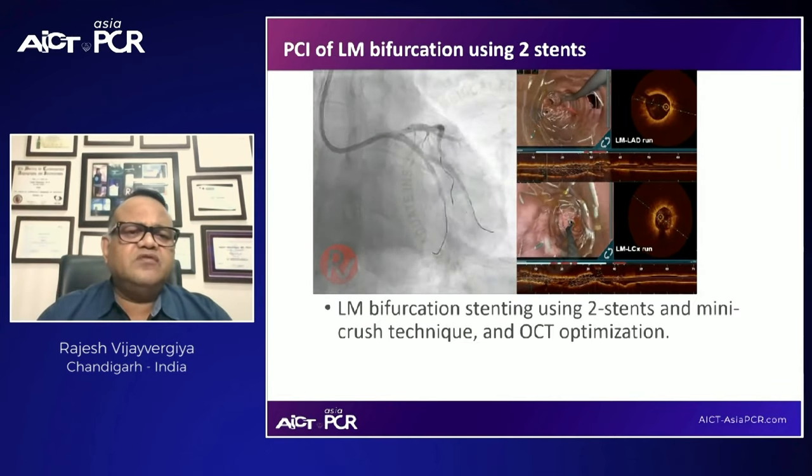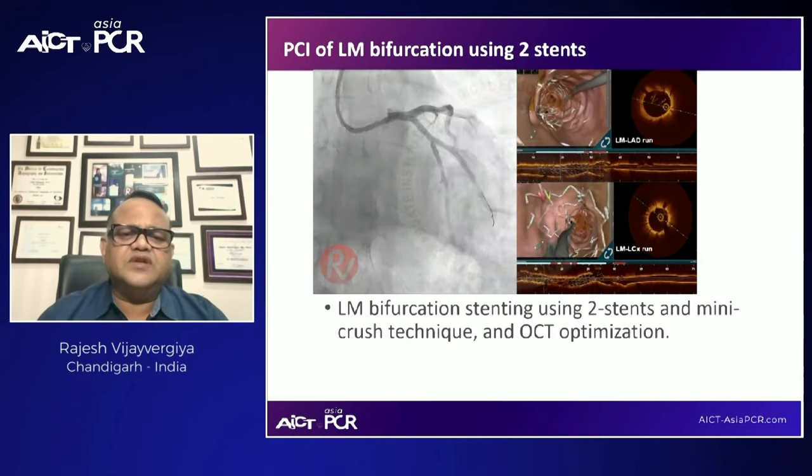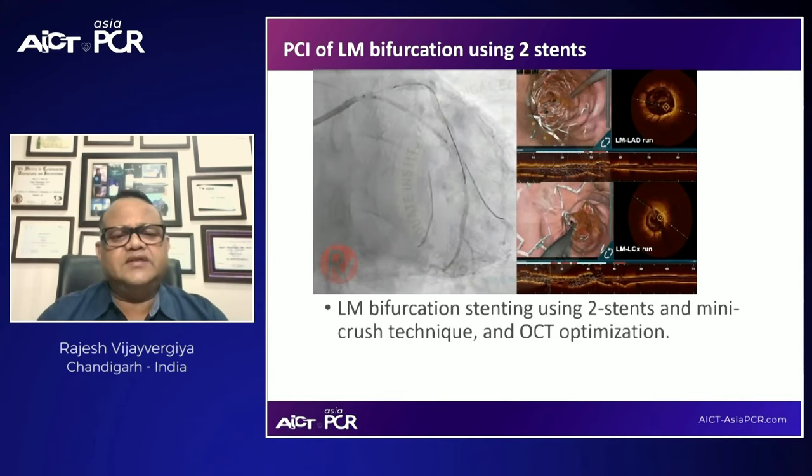So this patient underwent left main bifurcation stenting using a two-stent and mini-crush technique with OCT optimization and a good end result.